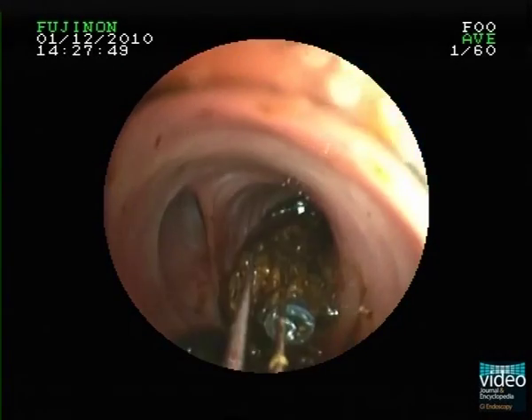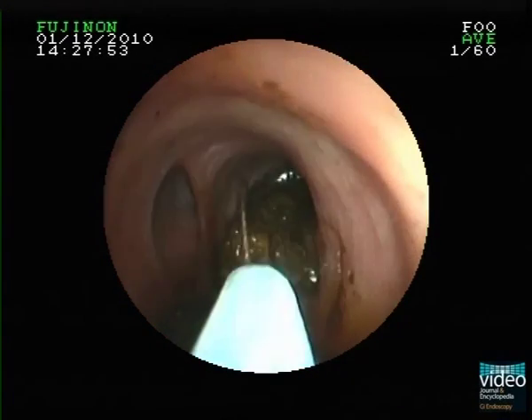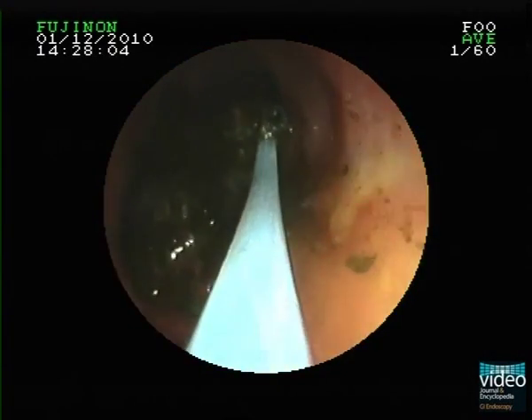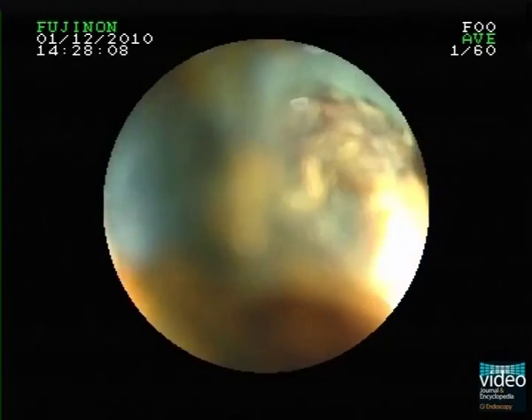In a next step, a snare is advanced through the 2mm working channel. Keep in mind that we more or less still work in inversion. Therefore, to decrease the resistance, it is helpful to apply some silicone oil in the working channel before advancing accessories. Under direct vision, it is now easy to engage the distal end of the plastic stent and pull it out of the common bile duct.